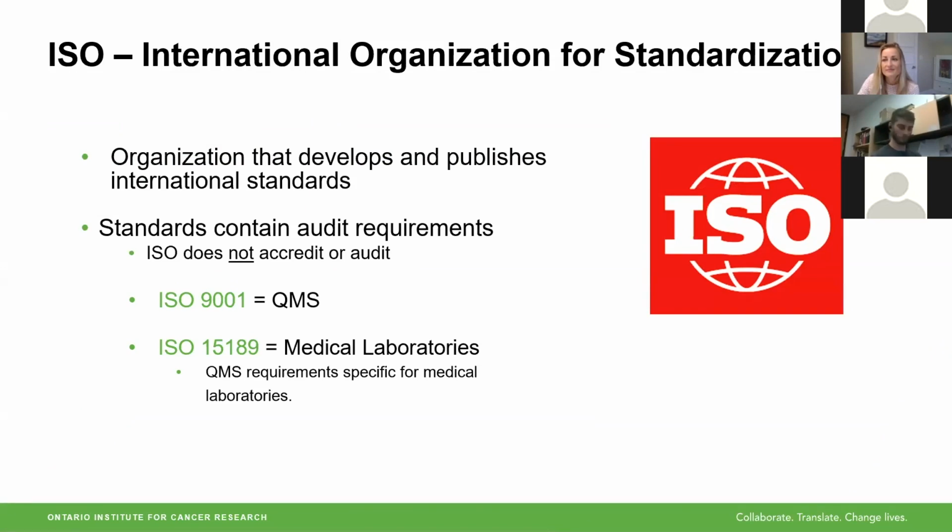And the standards are just audit requirements. So ISO doesn't come in and accredit you, they don't audit you, they leave it to another organization to do that. But the standards that are applicable to us here are 9001, which refers to quality management systems, and in particular 15189, which is quality management systems in medical laboratories.